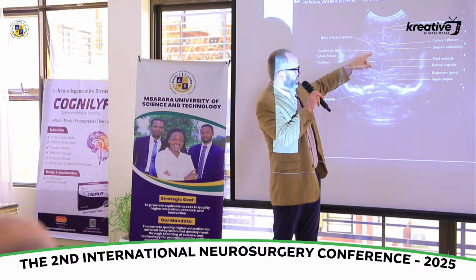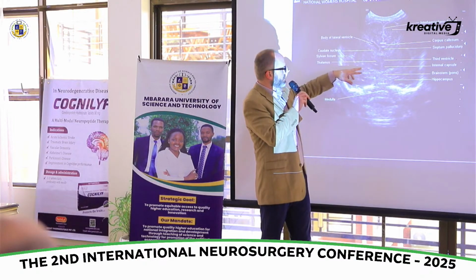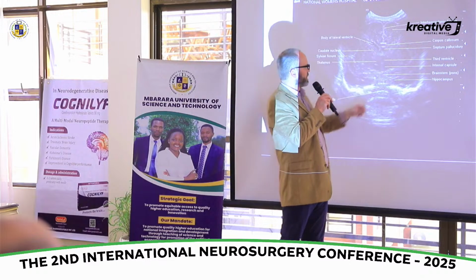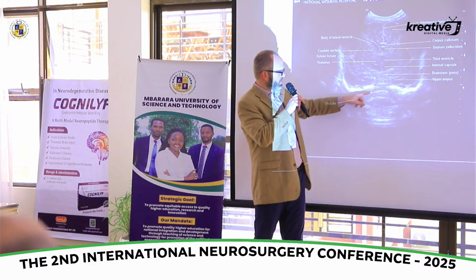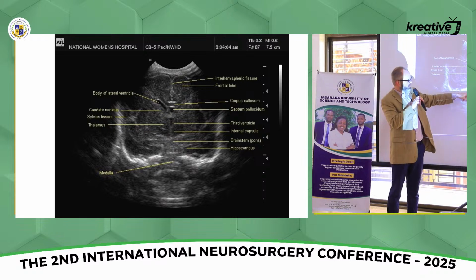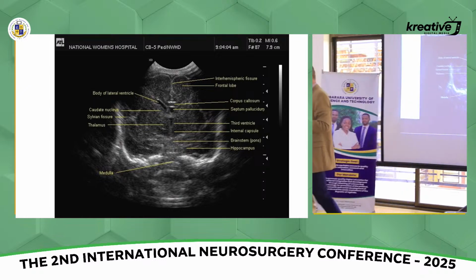The basal ganglia are going to be brighter because they're gray matter, and meninges are going to be quite bright. So you have interhemispheric fissure, and then if you get back, so this is medulla here, and what you're seeing there is the choroid plexus going out, foramen of Luschka, which is why it's bright. Otherwise, the brainstem is quite dark because it has such a concentration of white matter.